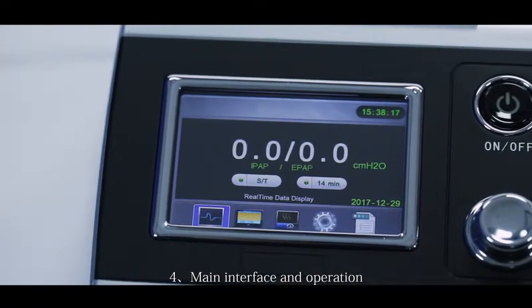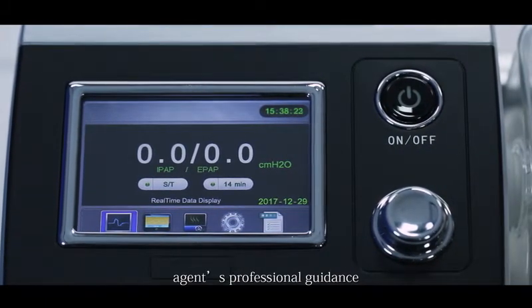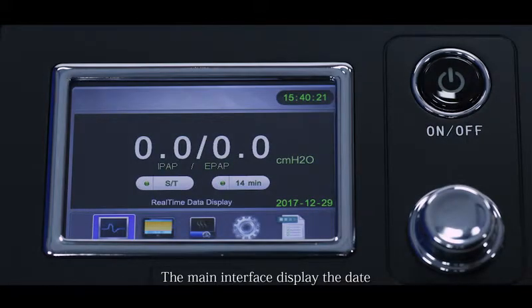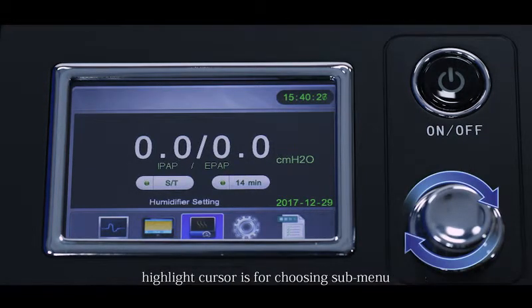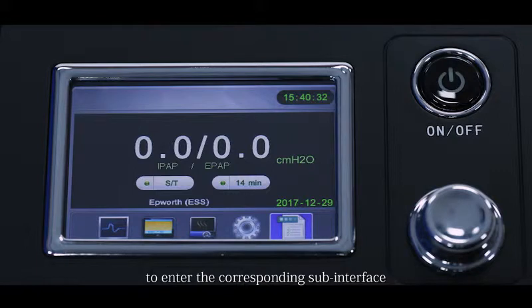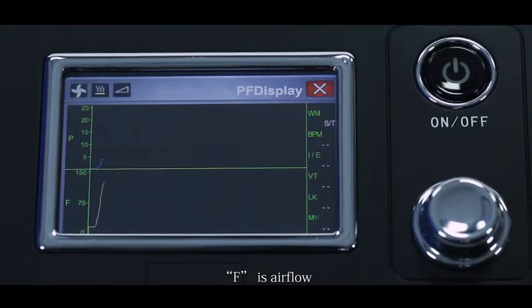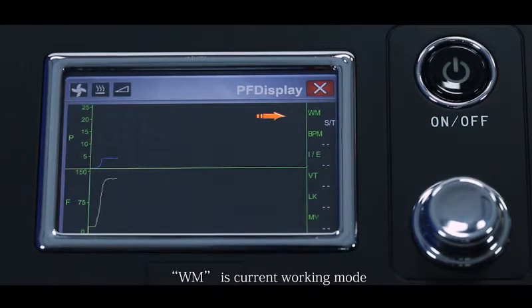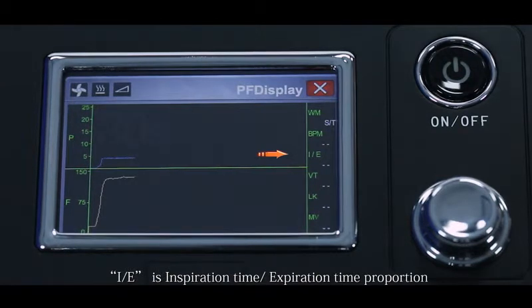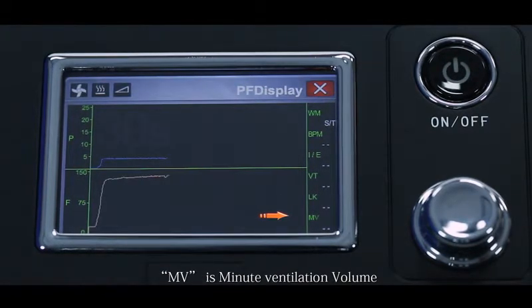Main interface and operation. When setting the parameters, please follow doctor advice or other professional guidance. The main interface displays the date, time, work mode, working pressure, and five sub-interfaces for setting parameters. Rotating the shuttle button highlights a cursor for choosing a sub-menu; press to enter the corresponding sub-interface. The first sub-interface displays real-time pressure and airflow data: P is pressure, F is airflow, WM is current working mode, BPM is breaths per minute, IE is inspiration-to-expiration time ratio, VT is tidal volume, LK is leakage volume, and V is minute ventilation volume.